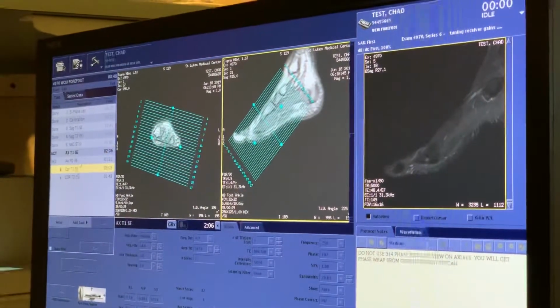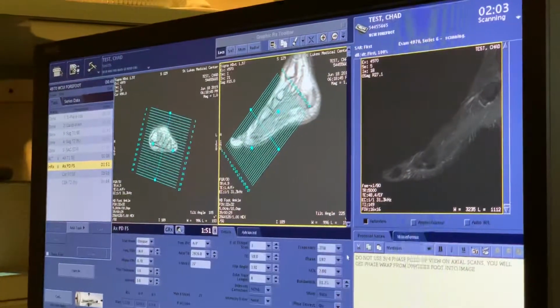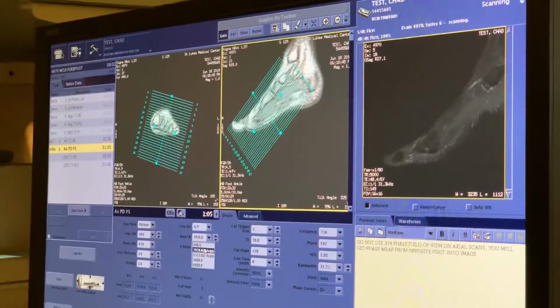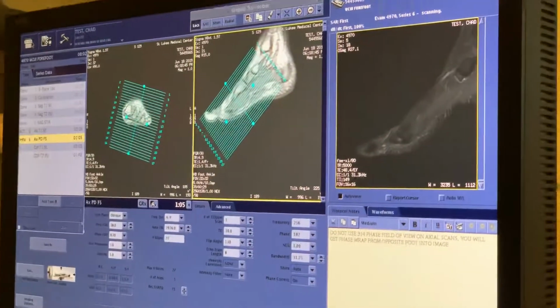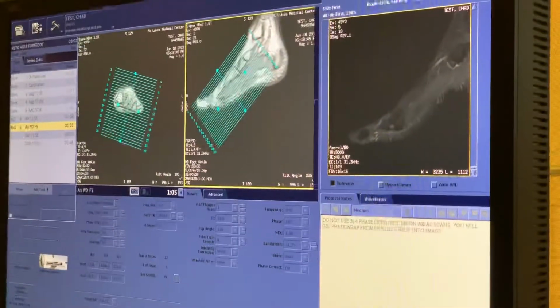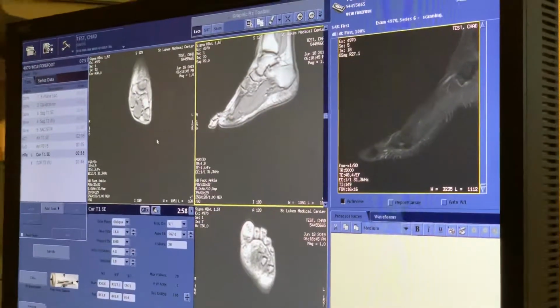All right, and let's check the PD, make sure that the parameters look okay for that. What does PD stand for? Proton density. Right. Okay. What are your TR ranges for PDs? 2,000 to 3,500. Good. Did you just read that? Mm-hmm. Yeah. All right. So we'll show you how to set up a coronal and we'll be done.